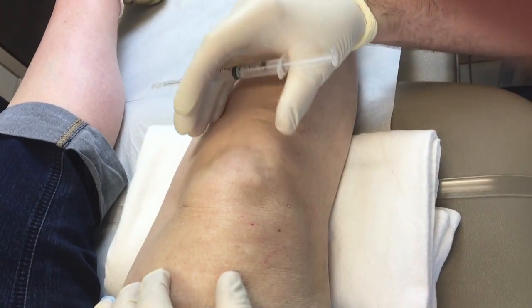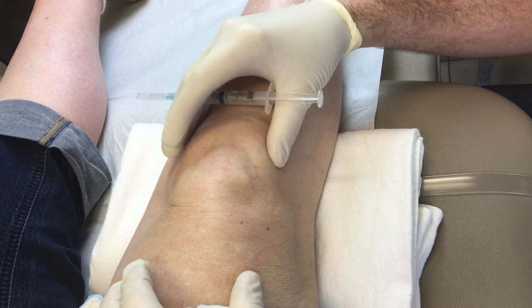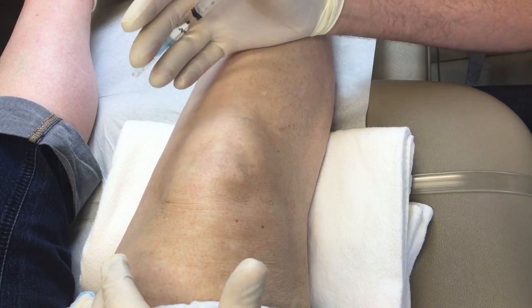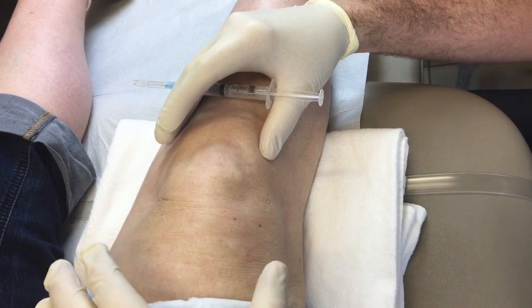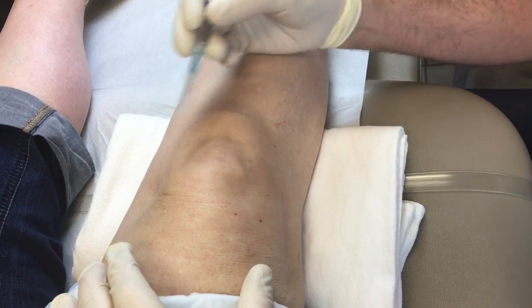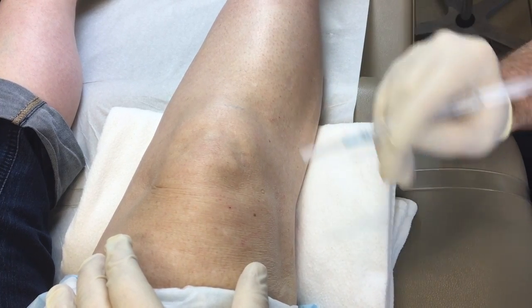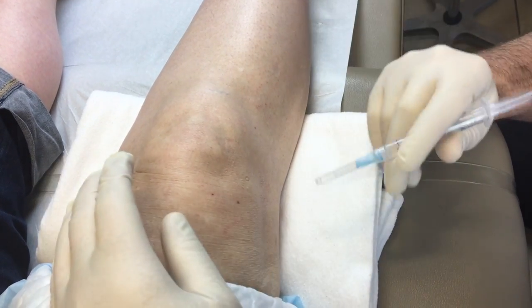This is Vicki. She's showing up today for her third injection of a hyaluronic acid derivative into her knee. We do these injections for a variety of syndromes — the most common one is osteoarthritis. We also do steroid injections for inflammatory conditions like rheumatoid arthritis, gout, or pseudo-gout. This being osteoarthritis, she's had steroid injections before and they helped a little, but came to a point where they weren't helping as much. Now we're trying to replace the actual material that typically cushions the knee.